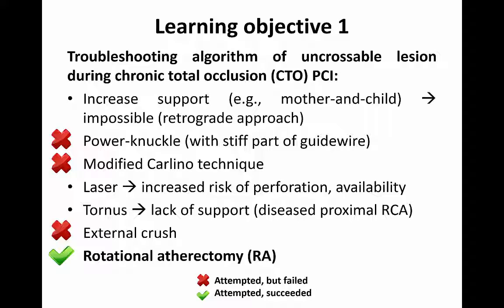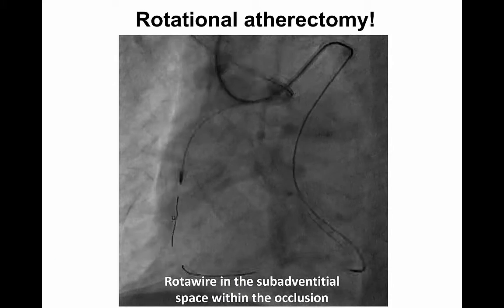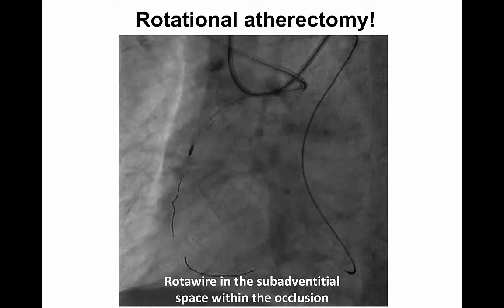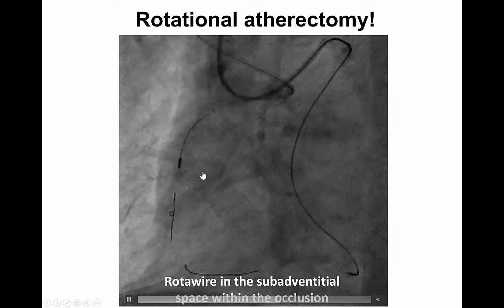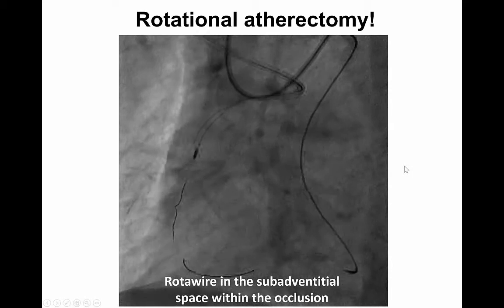We were left with laser, but this has the problem of availability in many cath labs, and we were also concerned about the increased risk of perforation in this setting. We also considered Tornus, but given the problem of support due to the diseased proximal RCA, we evaluated that this wouldn't work, and so we proceeded with rotational atherectomy. This video shows the rotowire in the subadventitial space within the vessel architecture, and rotational atherectomy being performed in the subadventitial space. You can see the rotowire overcoming the spot of focal resistance previously encountered.